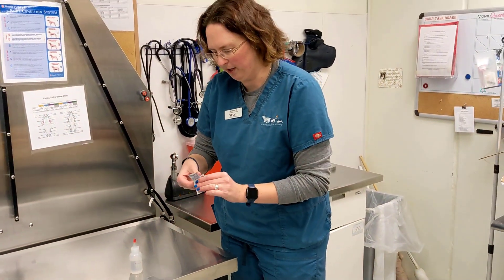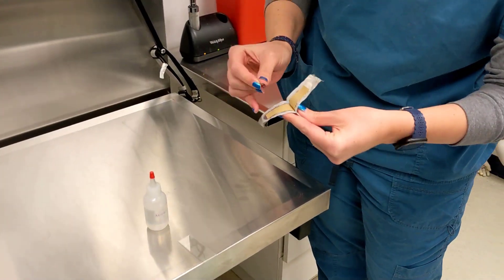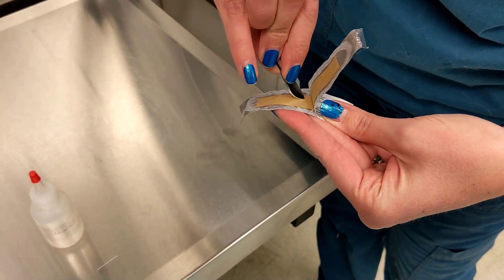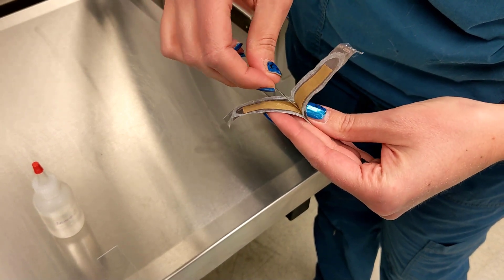So what we're going to want to do to prep is we're going to pull out our surgical blade. We're going to scrape it a couple of times just inside the packaging where it's still sterile. What we're doing here is we're just dulling the blade a little bit, because we don't want to slice through the skin on the animal that we're getting the sample from.